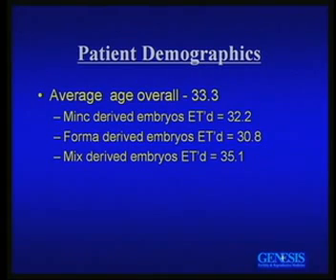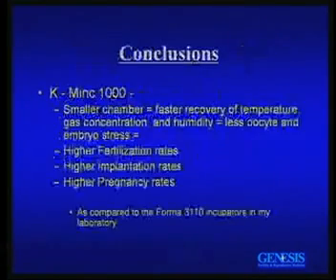The average age of our patients was 33.3. For the patients that had only MINC-derived embryos, the average age was a little over 32. For the Forma embryos, it was a little younger, 30.8, and the mix was our older patients, 35.1.